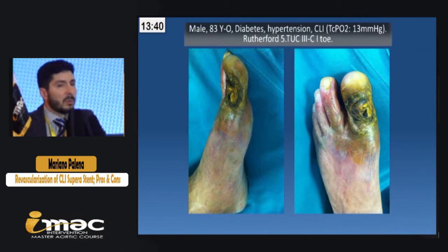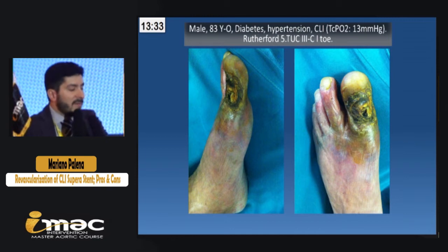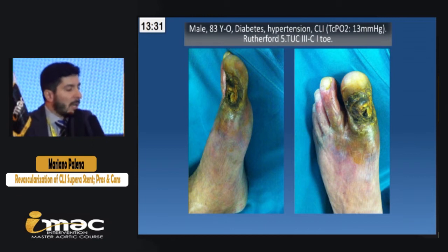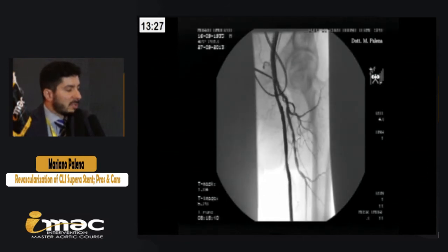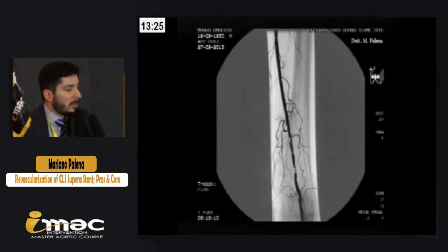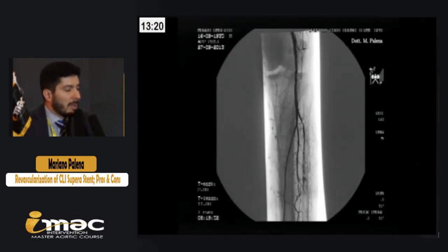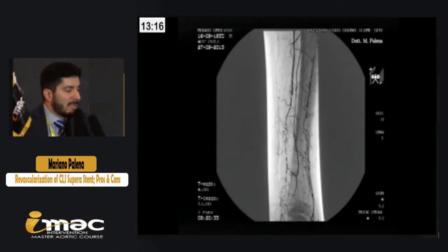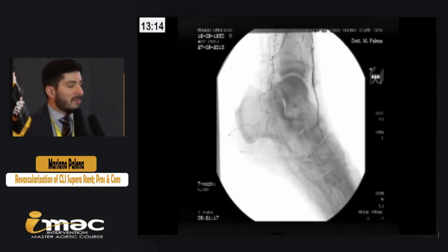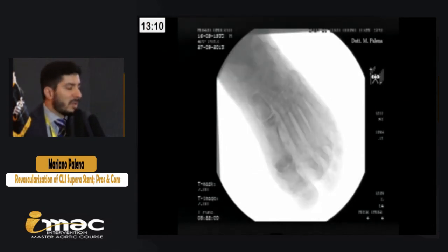Let me introduce the topic with a case. This is a male, 83 years old, with diabetes, hypertension, and CLI — as you can see, with first toe gangrene. Antegrade access in the common femoral showed lesions in the P1 and P2 segments, sub-occlusive, multiple stenoses in the proximal anterior tibial, an occlusion of the AT, and distal occlusion of the posterior tibial. So we don't have adequate blood flow for this foot. The main vessels are absent, but we do have a tarsal artery.